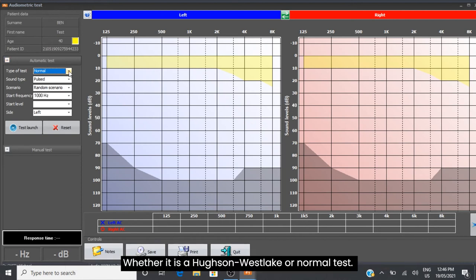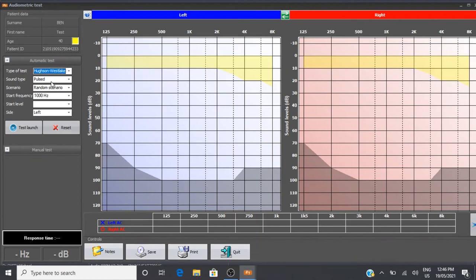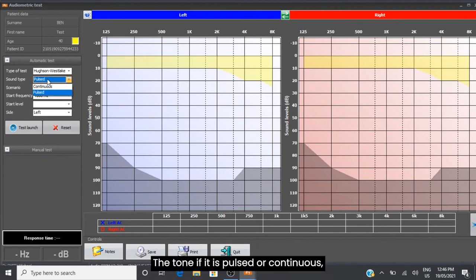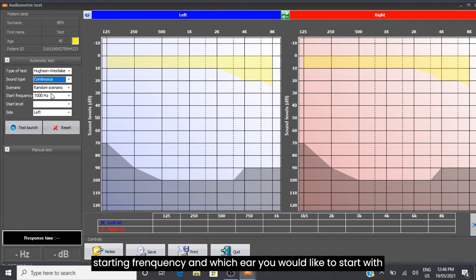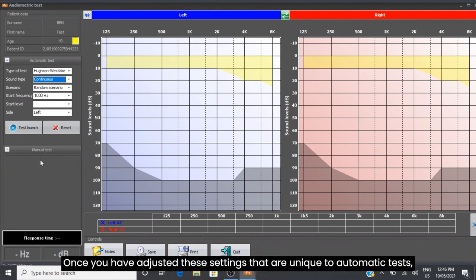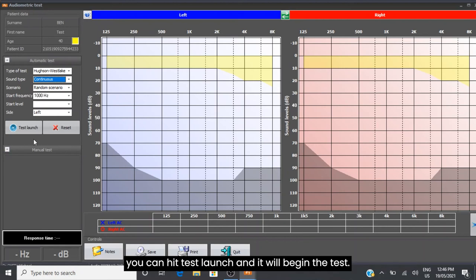Select whether it is a Hughson-Westlake or normal test, the tone (pulsed or continuous), the scenario type, starting frequency, and which ear you would like to start with. Once you have adjusted these settings that are unique to automatic tests, you can hit Test Launch and it will begin the test.